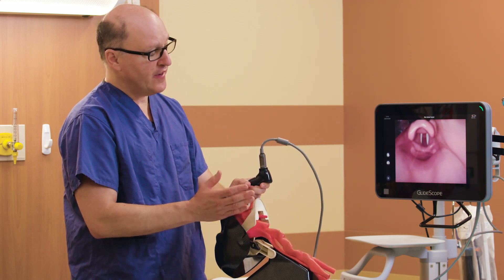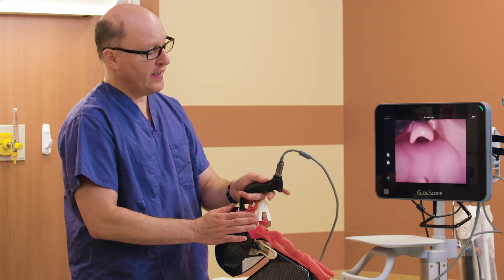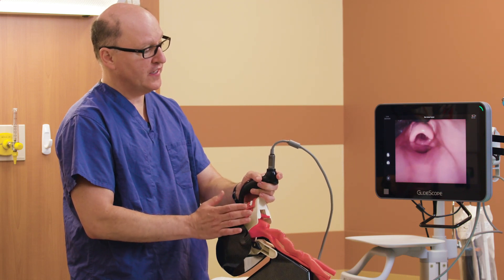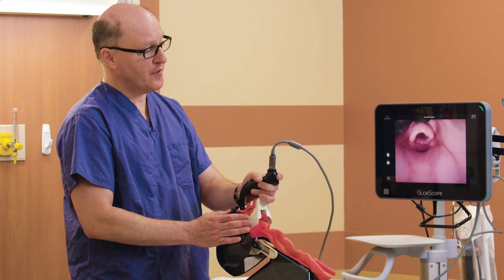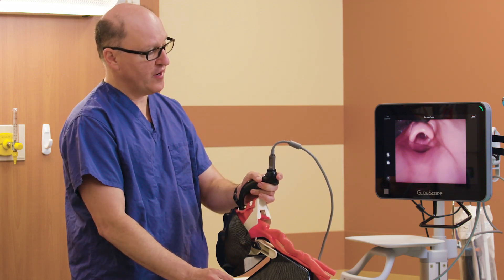I find in most adults a three works fine. If you use the four, make sure that you do not over-insert. This is more than enough of a view with the four to optimize tube delivery without over-angulation relative to the trachea.